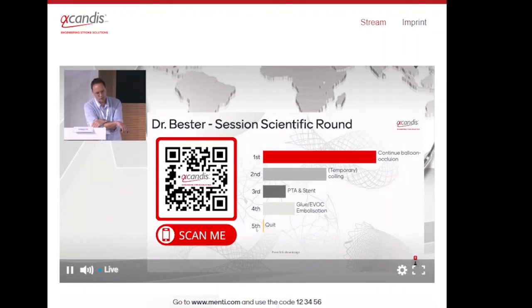Okay, very interesting. So actually, I told you I was not in charge. I think, like we say, retrospectively thinking, it's always difficult, but I think I would have continued with balloon occlusion as well and would occlude and delay it and wait and do longer occlusions, but I think we'll continue with the slides.